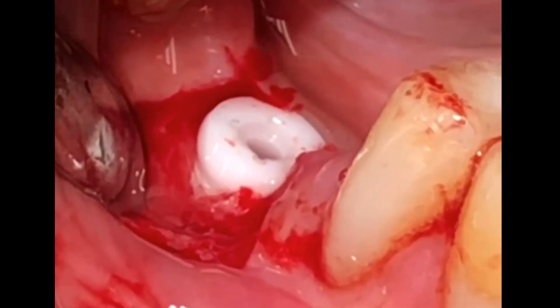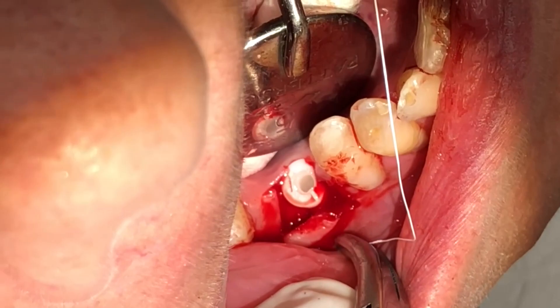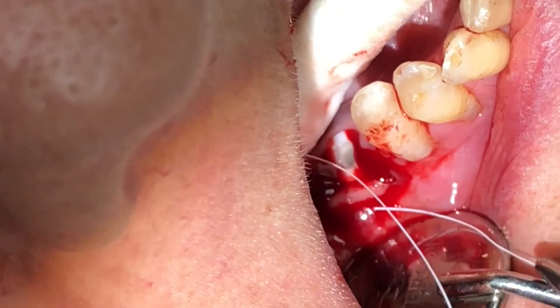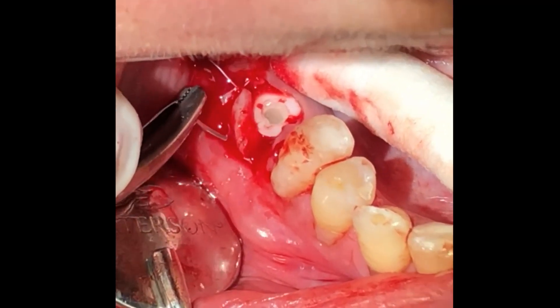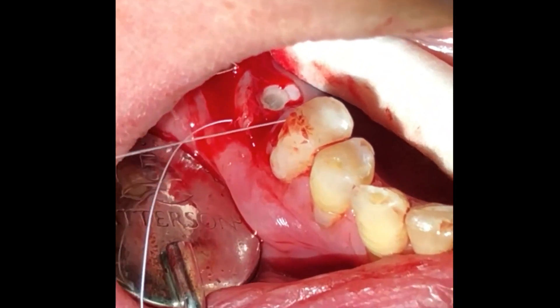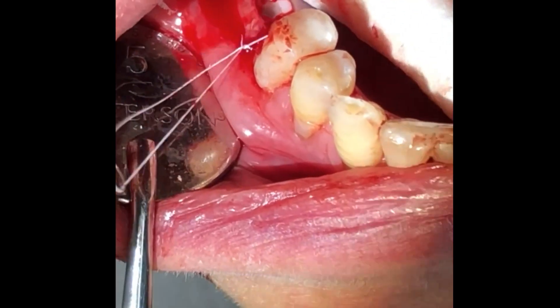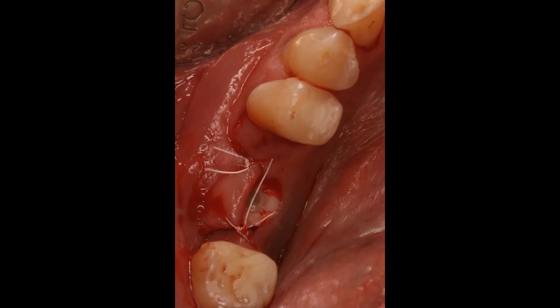Before suturing, we cover the top of the implant with a healing cap — in this case I've used Trim by Rocco, but I suggest you use the healing cap which these days is quite low profile. Then I proceed suturing the flap on the facial aspect of the implant with PTFE 4-0 sutures.